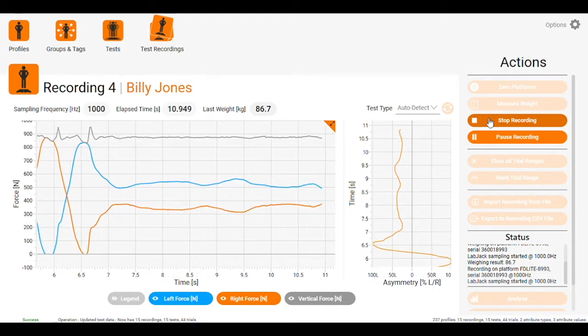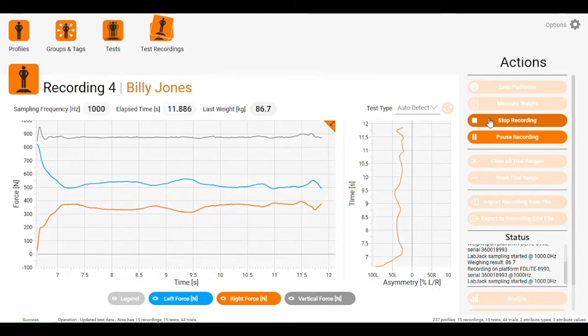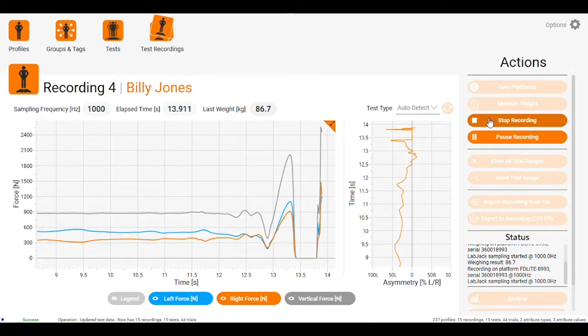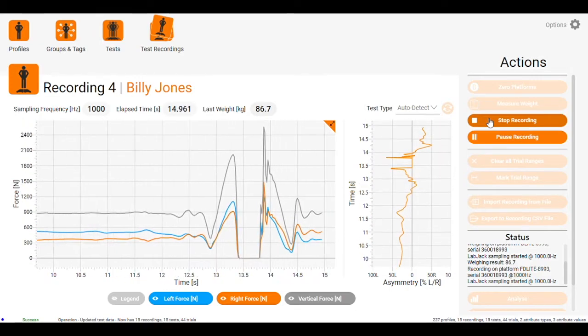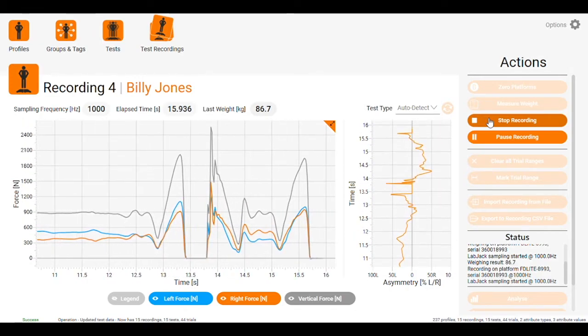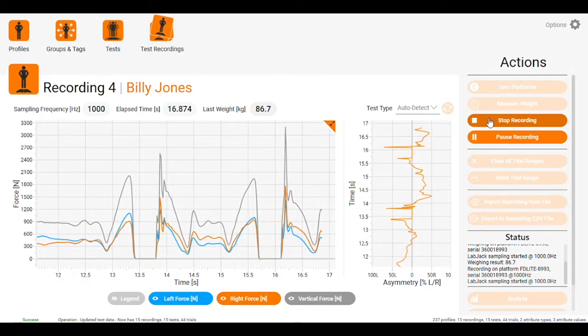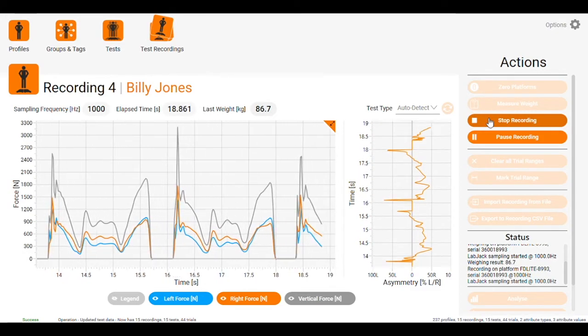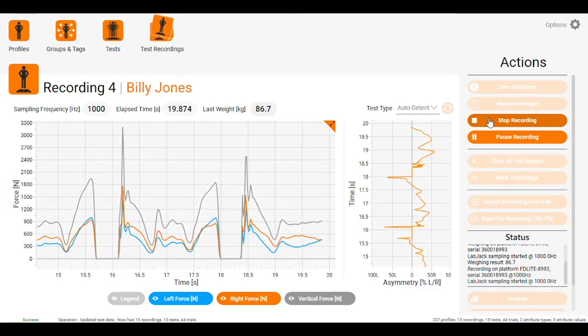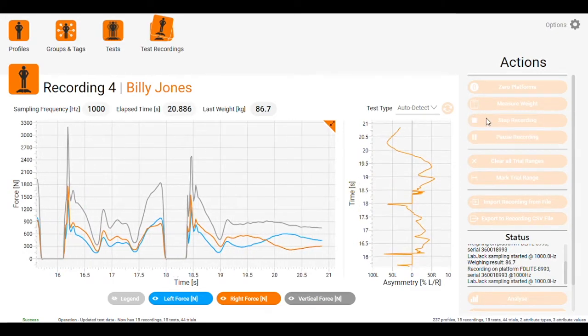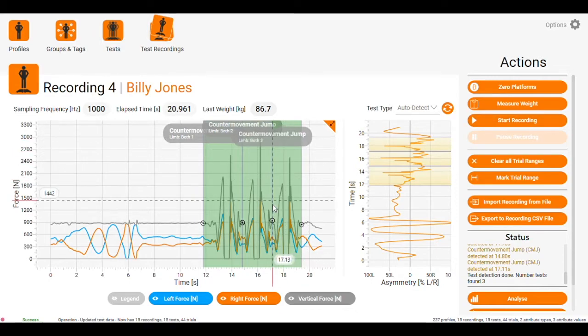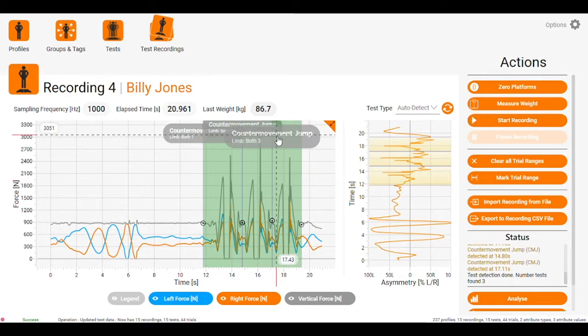From there, if we do some countermovement jumps, the screen will record that. If we hit stop recording, we can see that our three countermovement jumps have been picked up here.